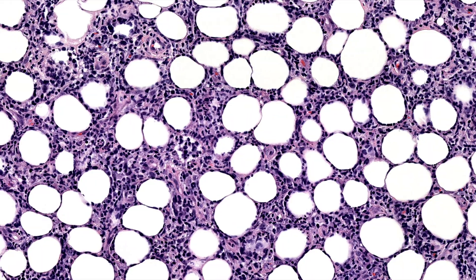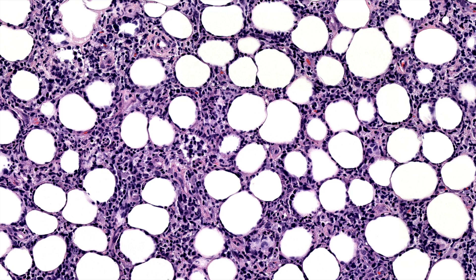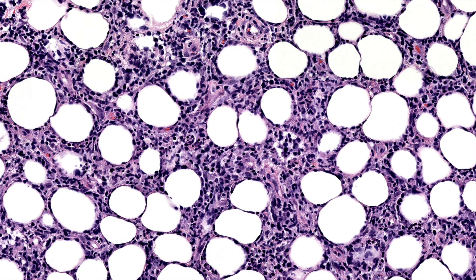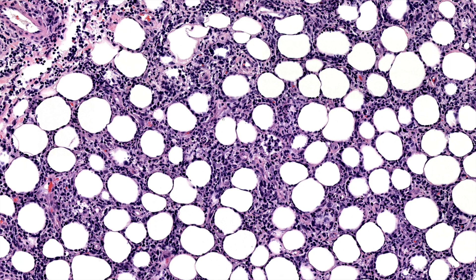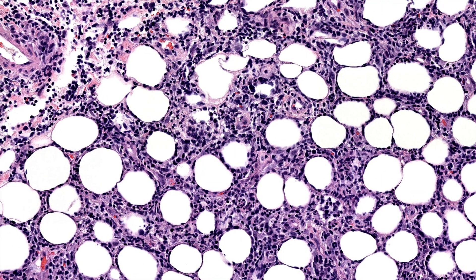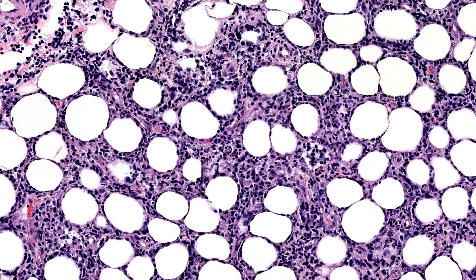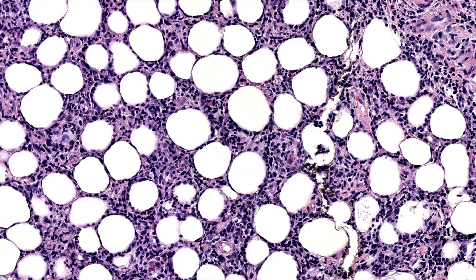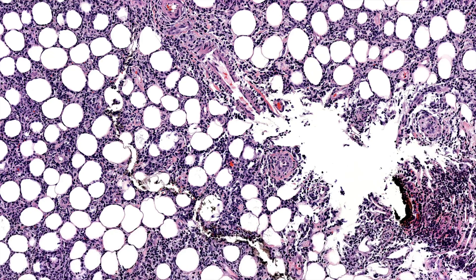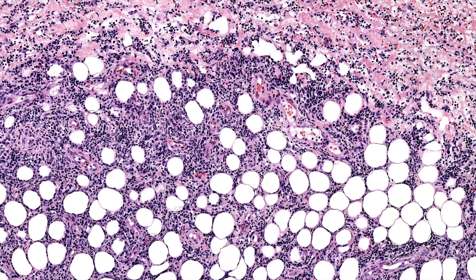You may also have cells — like this might be one — that are like a histiocyte with little fragments of karyorrhectic debris in them that are called beanbag cells. So you often have karyorrhectic nuclear debris, and sometimes the histiocytes will eat that debris up and you'll see little fragments inside a histiocyte. I don't know if that's the best example, but that's kind of giving me that feeling — it's giving beanbag cell.